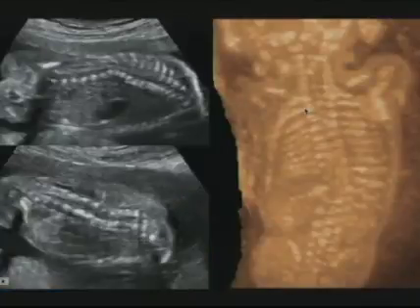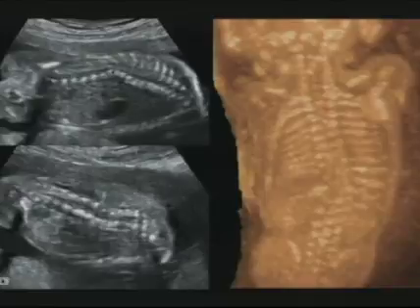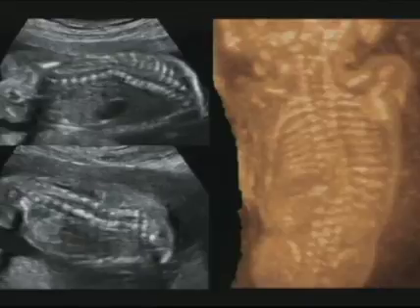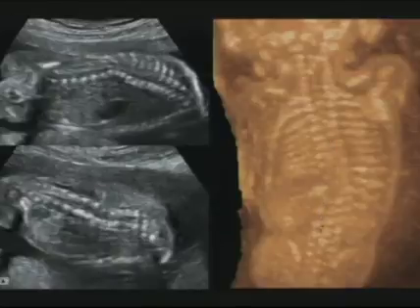Here's another case that came in because of a kink in the spine seen on another scan at another facility. And here is the kink right here. It's a hemivertebra. It's a vertebral abnormality. And when I took the entire volume to look at the entire spine all in one image, I was able to render it as a skeletal mode.